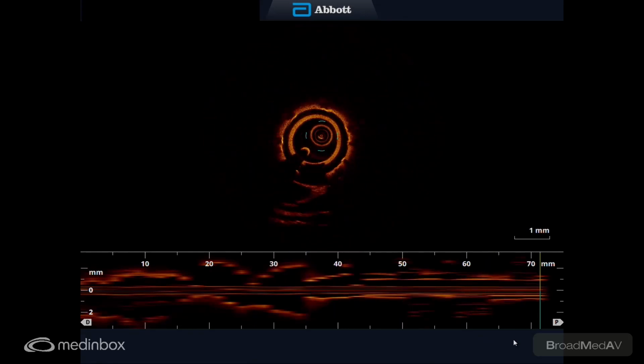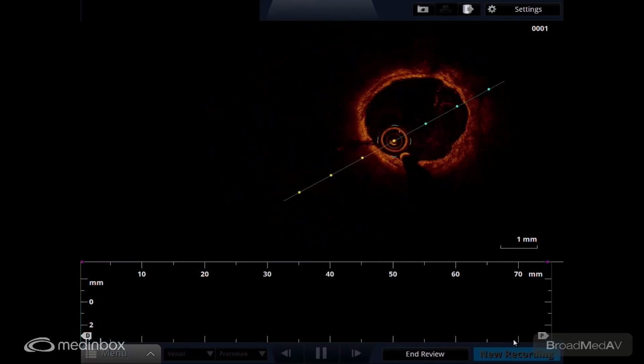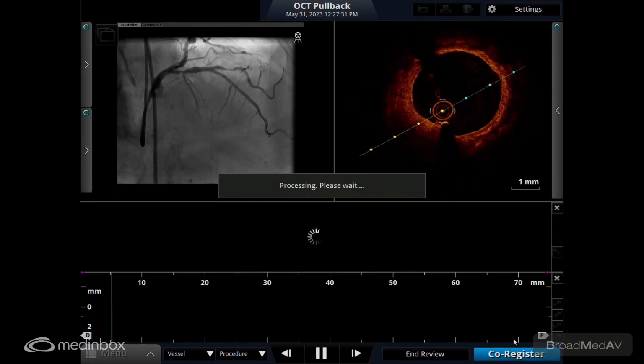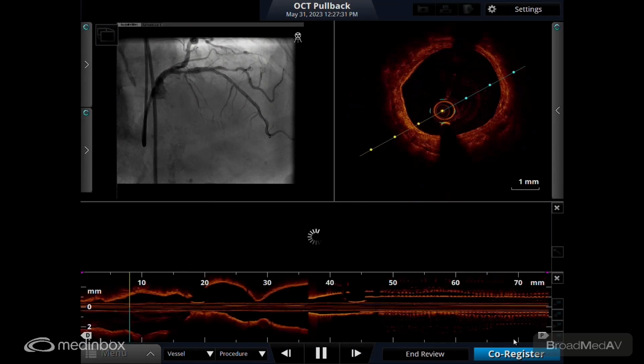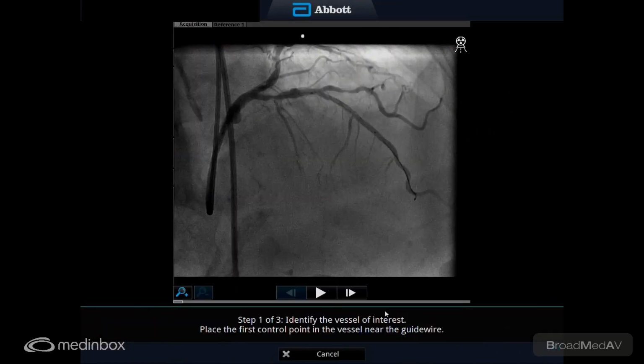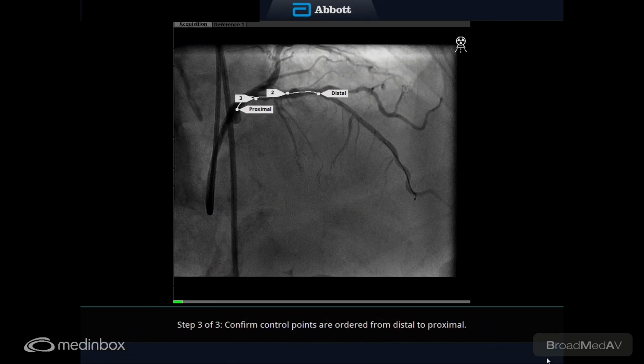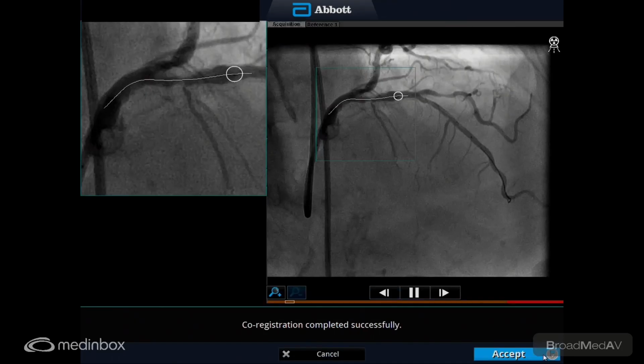Beautiful. All right, okay. We'll walk this guy out while we register. We got a good picture there. Going to come out with this. Make sure we don't get tangled on this stuff. Let's go register this thing. There we go. I'll give you the OCT here. I hope I didn't take that last line. Let's see what we see here. I think that's a good one.